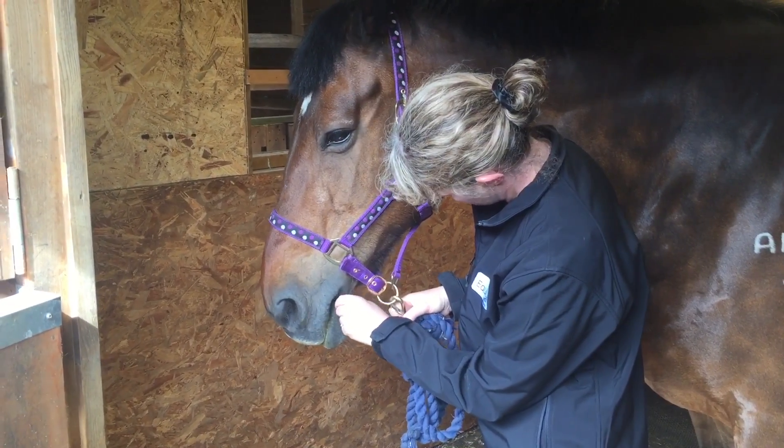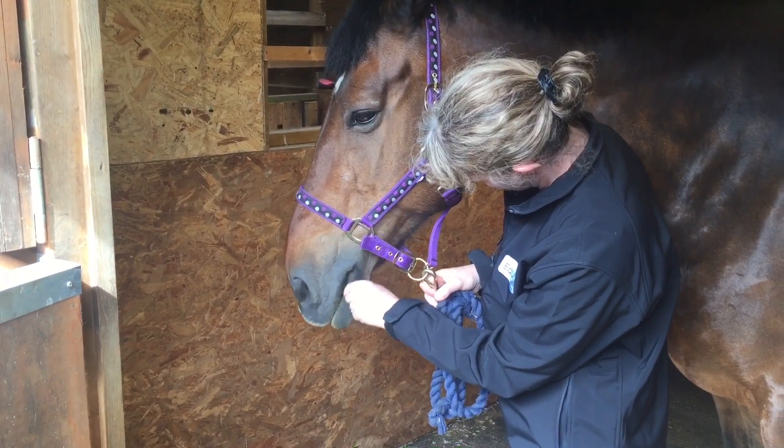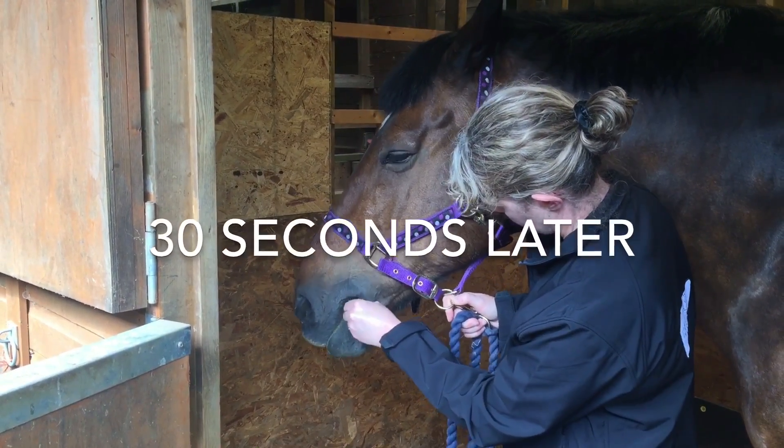Some horses will not move their tongue much, as Amma is doing here. It can be helpful to move the swab gently back and forwards to encourage the horse to move the tongue. Most horses try to push the swab out with their tongue, so all you need to do is hold the swab in place.